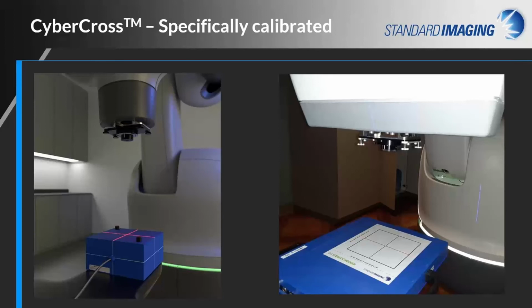It is easily attached for alignment, then detached for QA procedures, such as delivering QA plans for analysis with, or preferably without, film.